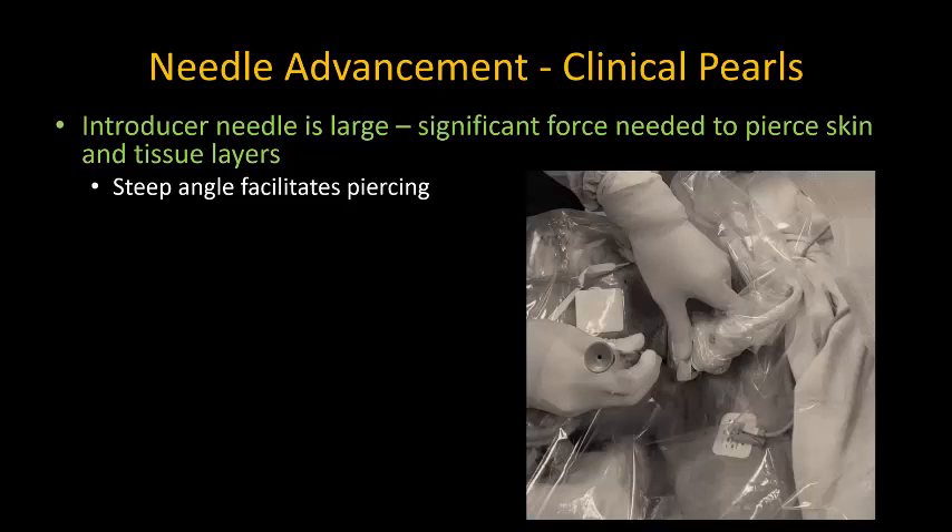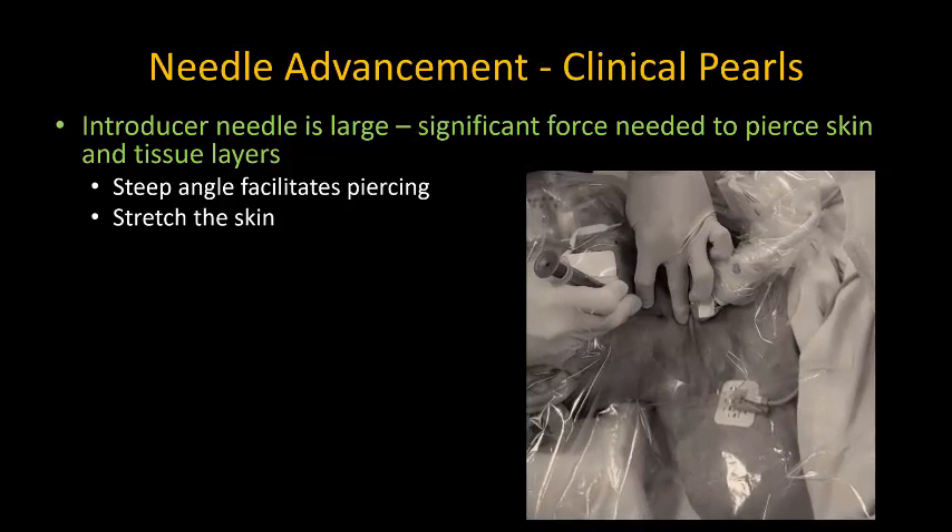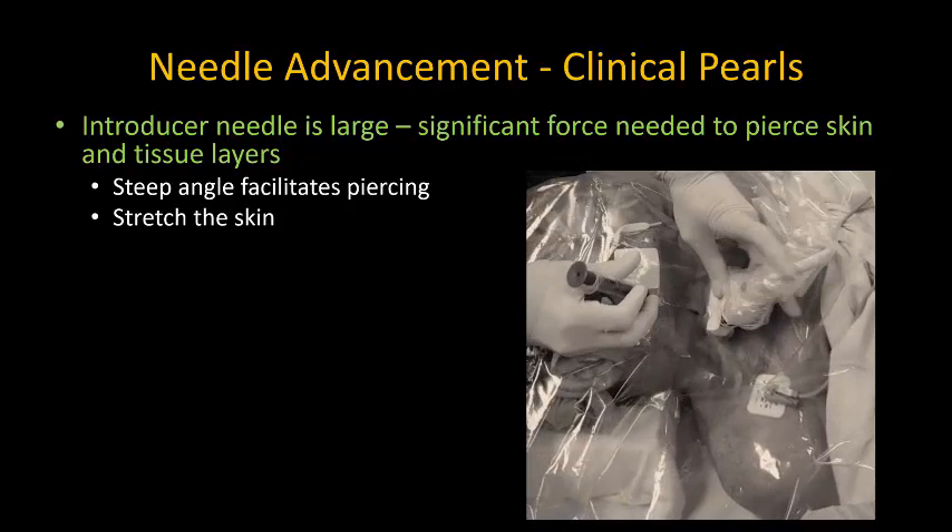I also don't worry about trying to aspirate on the syringe at this point. Rather, I hold the syringe in a way that gives me maximum control over the needle insertion. Another thing that helps if you're having trouble with penetrating tough skin is to stretch the skin with the other hand. Put down the probe temporarily if you have to, and aim just to enter into subcutaneous tissues in a very controlled fashion.